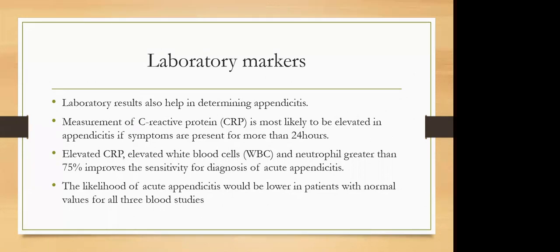So as a sonographer, when you're trying to scan patients with suspected appendicitis, you need to have an idea of how their bloods were, or what they were finding for the bloods. Those give you an idea that when you're scanning with the laboratory findings, there should be appendicitis, or there's no appendicitis and there may be other causes of the pain.